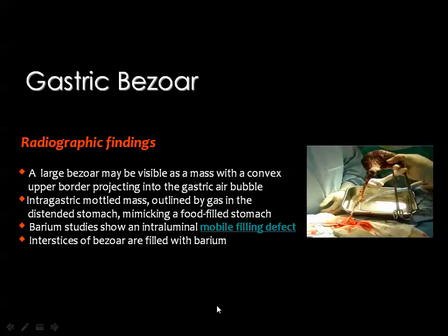And this is the surgical evacuation of one of the gastric bezoars, the packed hair material, which is taking almost the shape of the whole cavity of the stomach.